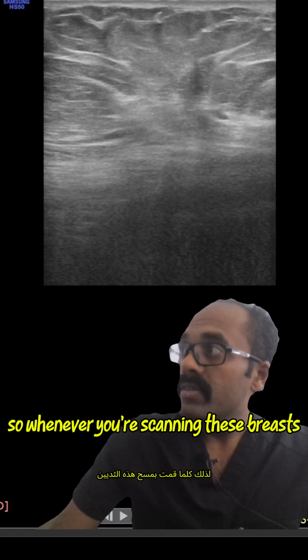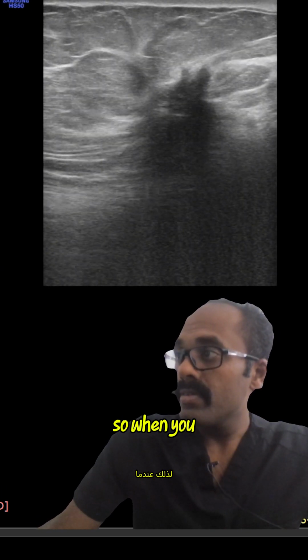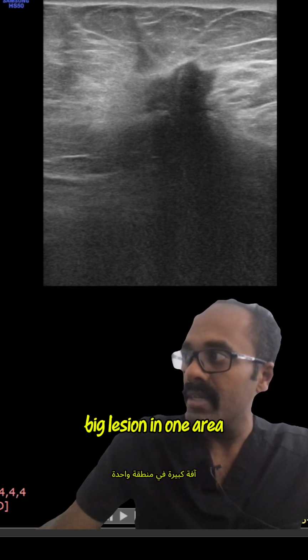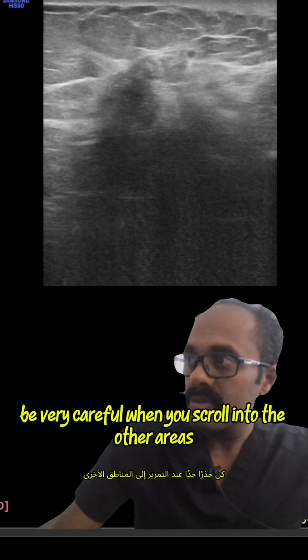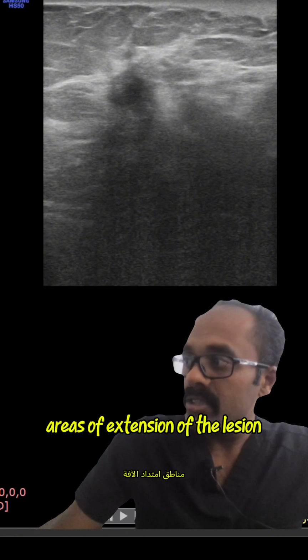Whenever you're scanning these breasts, you've got to be really careful. While you do obviously see a striking big lesion in one area, be very careful when you scroll into the other areas, because these are all possible areas of extension of the lesion.